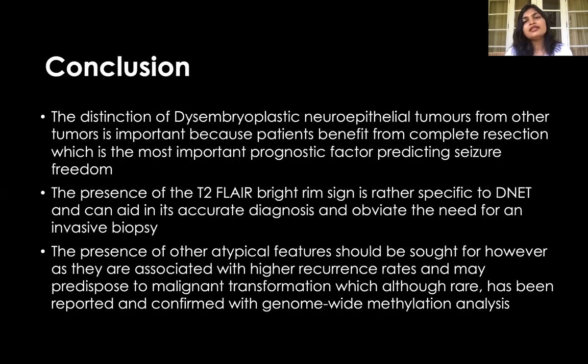Conclusion. The distinction of DNET from other tumors is very important because patients benefit from complete resection, which is the most important prognostic factor predicting seizure freedom. The presence of the T2 FLAIR bright rim sign is rather specific to DNET and can aid in the accurate diagnosis and obviate the need for an invasive biopsy.